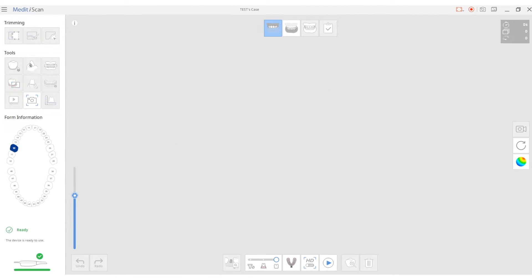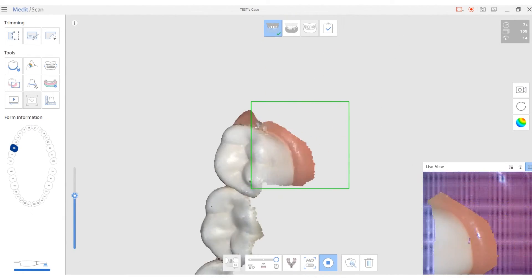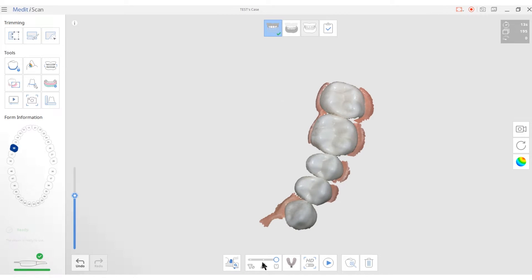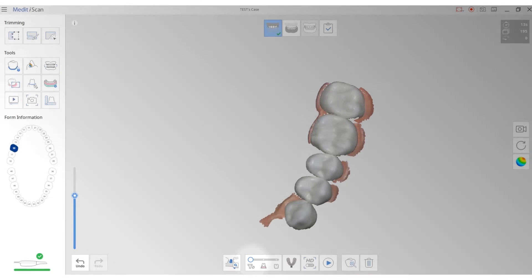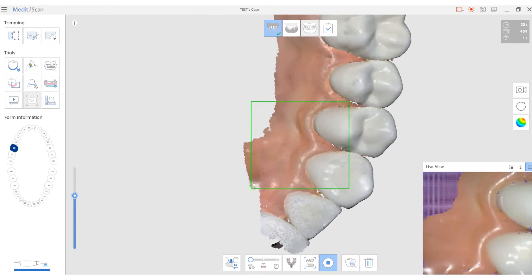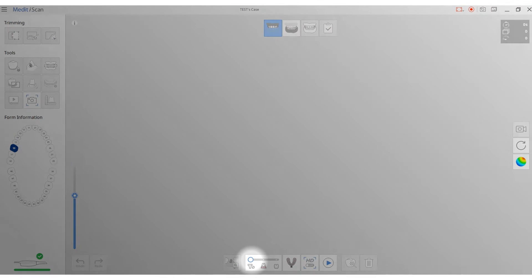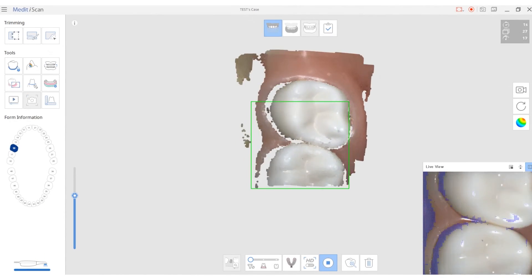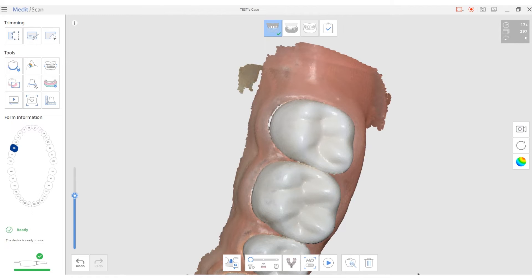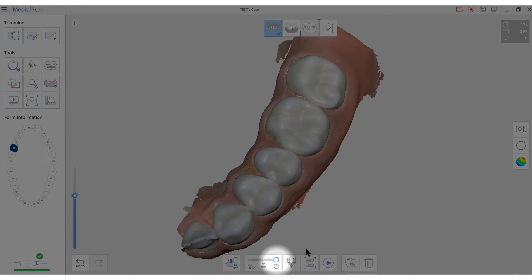Users can always scan with the third filter option first, then scan with the first filter to add soft tissue data. In contrast, users can also scan with the first filter option first, then additionally scan with the third filter to capture tooth structure data.